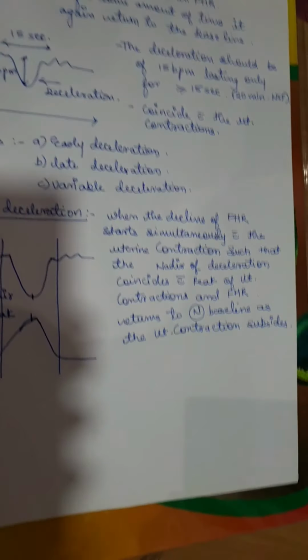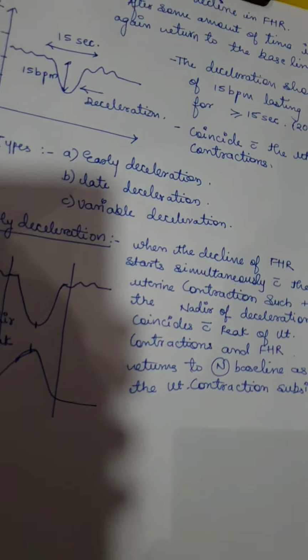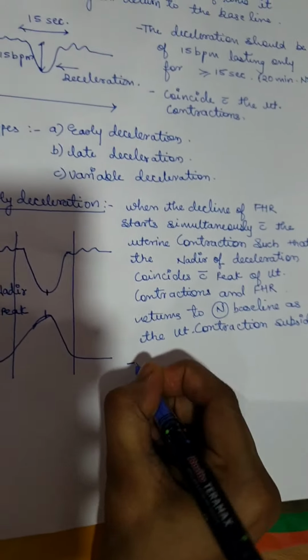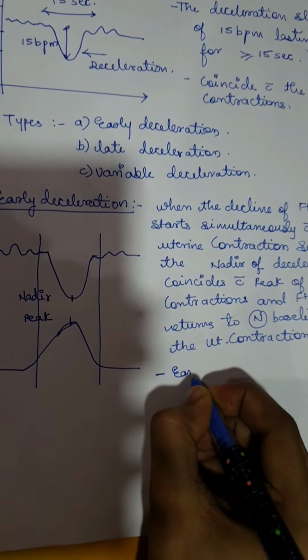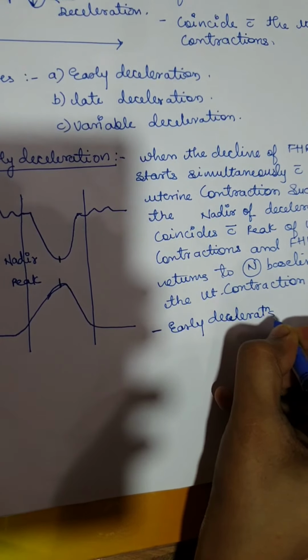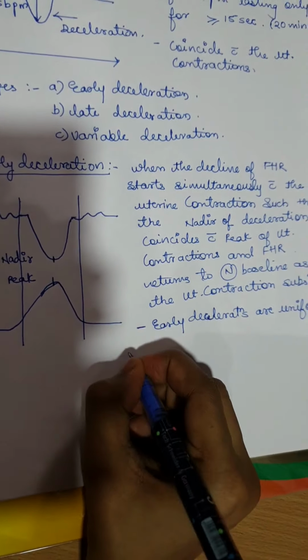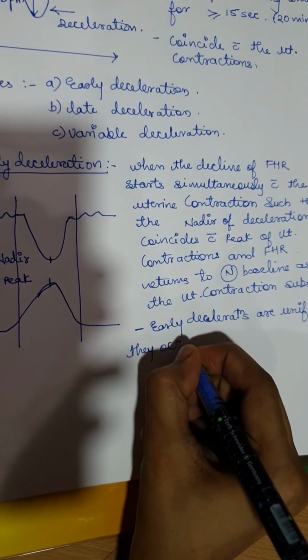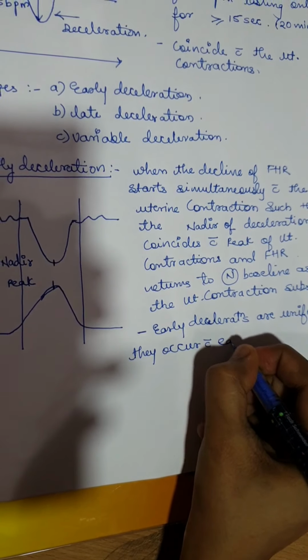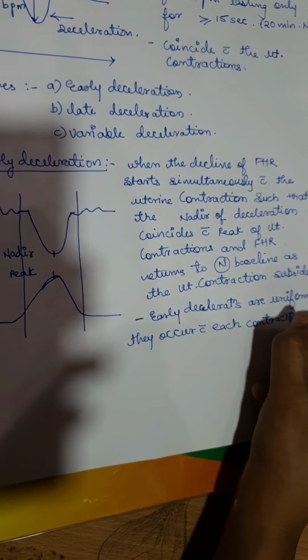The early decelerations are uniform, meaning they occur with every contraction.